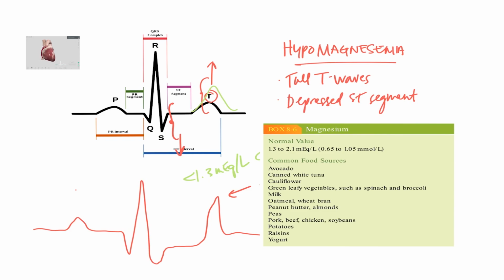So where's the ST? Oh, you know what? I guess this thing had a use after all. So the ST segment is here, where the S wave plateaus before the T wave slope comes up. And depressed means it's kind of the opposite of ST elevation when people have heart attacks, and angina, and wait, not angina, but let's see, like an atrophied muscle due to a heart attack. So like God, there's another word for it.